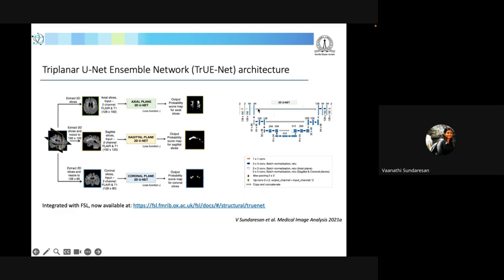Now these skip connections, the arrows that go directly from encoder to decoder, are extremely important, because these are the arrows that combine the texture-based features with the location-based features to get the final output. This makes the UNet model a very powerful model for medical image segmentation.